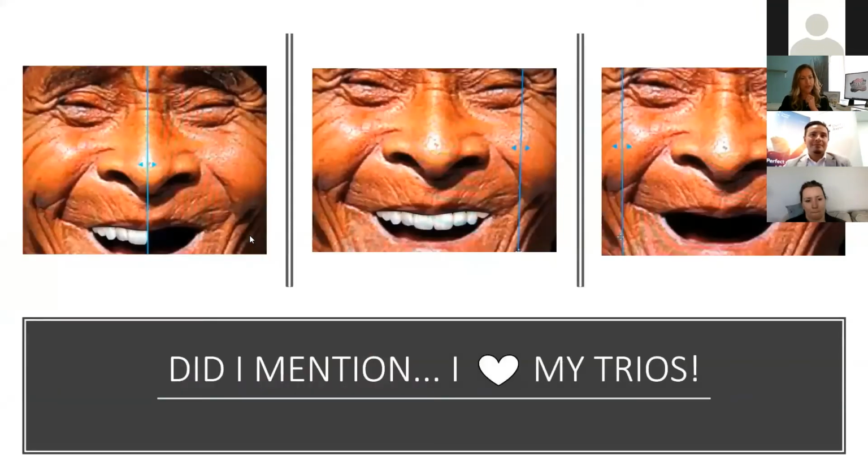So this was a fun slide that I just randomly found. We've had patients that come in, and so have you, who have no teeth. The reason I put this picture in is because when you're taking your photo for the smile design, you can't have them give just a little smile. You need to say, bite together and give me your full smile. A lot of people are embarrassed to do that, but you want that negative space, and what do you have to work with? Some patients don't have that bite or teeth to reference, so you have to get them to just smile and find some negative space so you can drop some teeth in there to give them that sneak peek. And yes, I love my TRIOS.